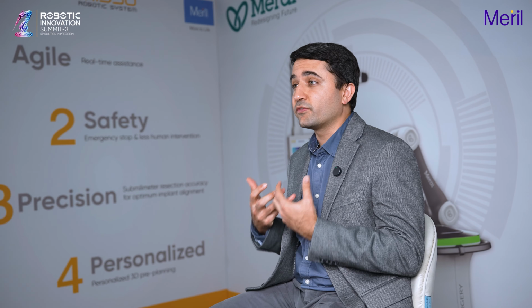Now what we do with those gaps is still evolving. Whether you want equal gaps in extension, flexion on medial and lateral sides, whether you want unequal gaps, how much of it has to be unequal, all these are still evolving. But the fact that we have an understanding and we can go and get what we want to achieve is a big advantage of robotics.